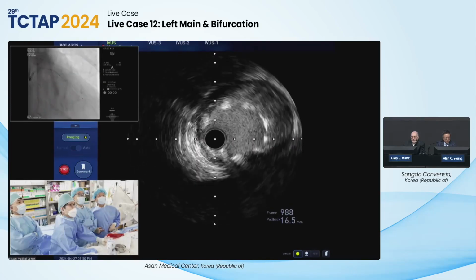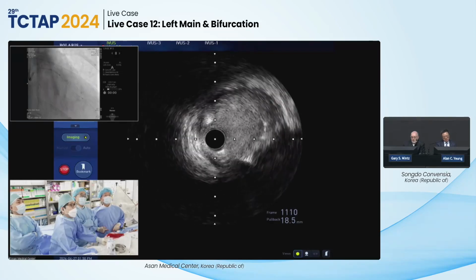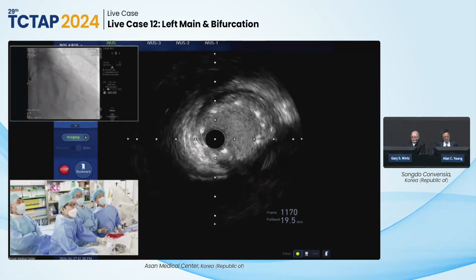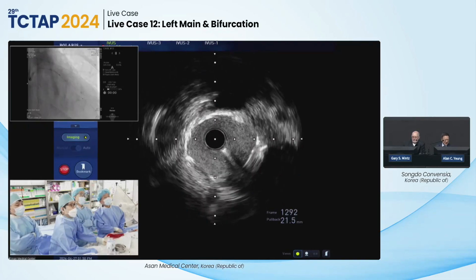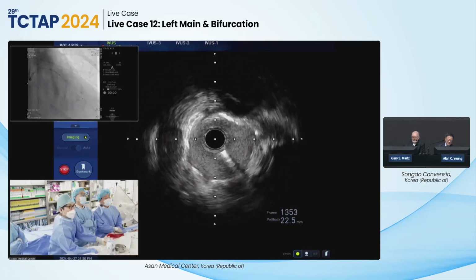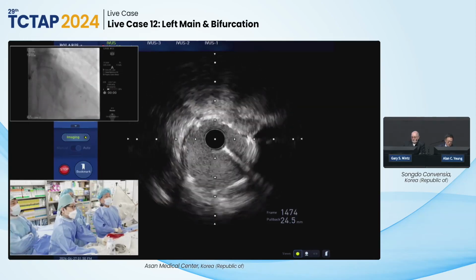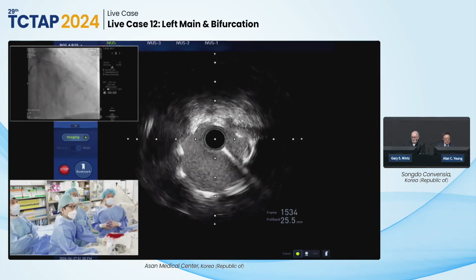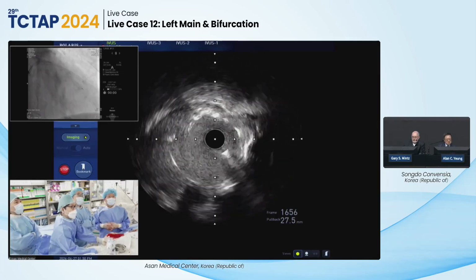Yeah, this is an aneurysmal part. And this is small. It's all a little small. All right. That's what Alan just told me. Okay. In the very proximal part we deploy the 3.5 high pressure up to 3.7 or something, right? That's the circumflex.